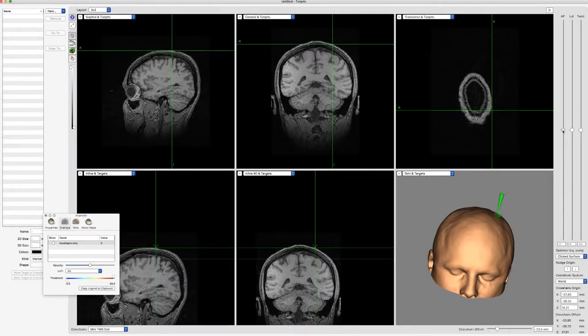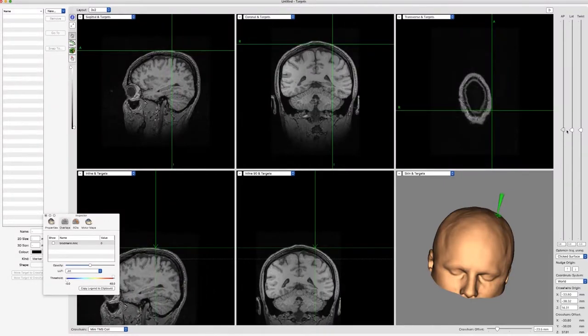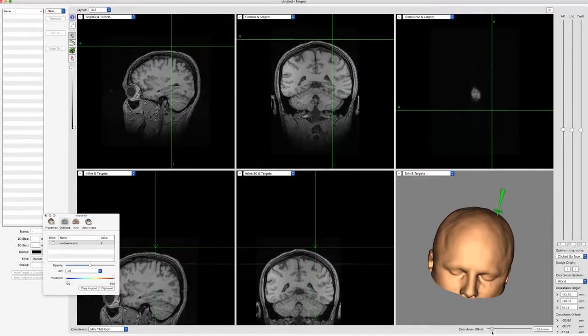And then you've also got here, what you want to do is we want to use this bottom dotted line here. So we want that to be on a tangent when we stimulate. So we're looking to get that nice and flat underneath there. So we move that crosshairs origin out a little bit.